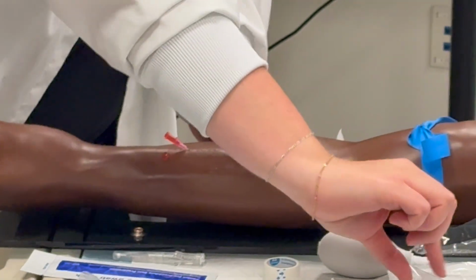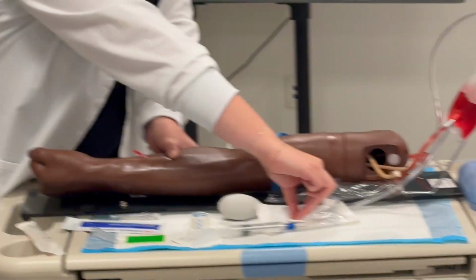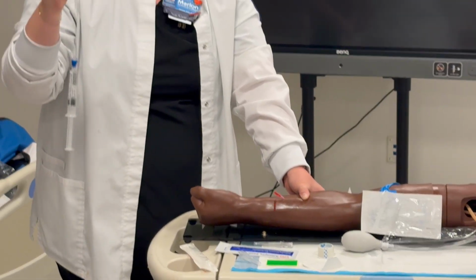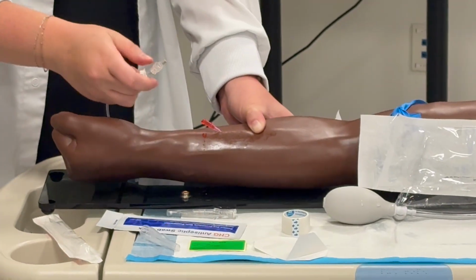I'm going to grab into my package. I don't care about grabbing the flush, I'm grabbing this part. And you can release the tourniquet at this time too. Okay. I'm grabbing this part. This is the part that connects to the patient. So don't grab it by the flush, grab it by this. This is what you need control of and what needs to stay sterile. Can I touch here? No.